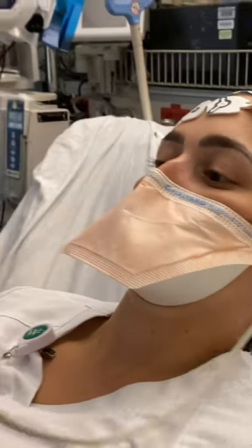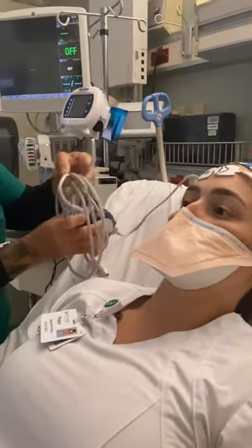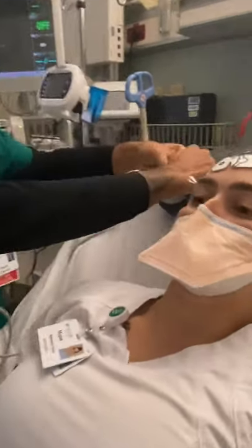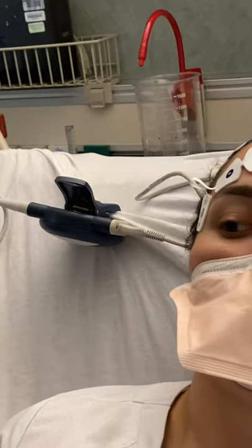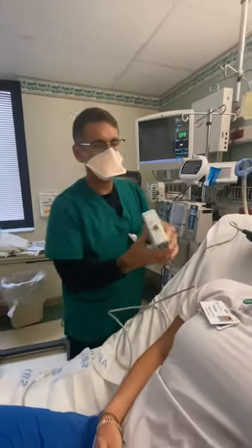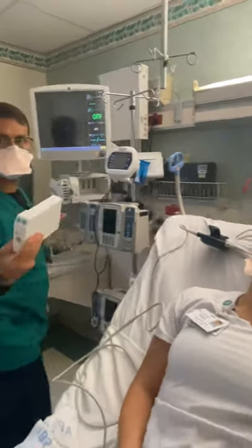This is going to be draped around the top, and you're going to clip this module somewhere safely on the bed so it doesn't fall, because these are very expensive modules. And now you're going to have the cable. The module is going to go in one of the slots for the monitor.